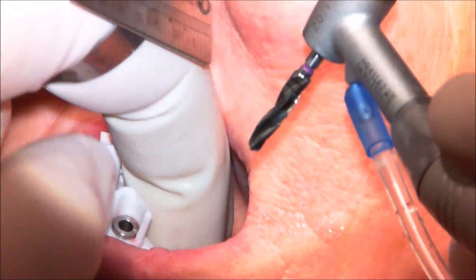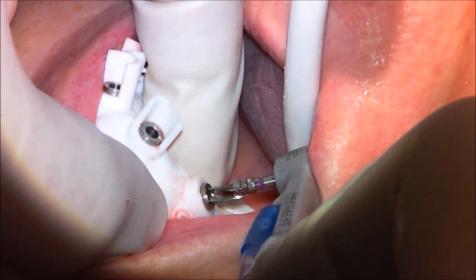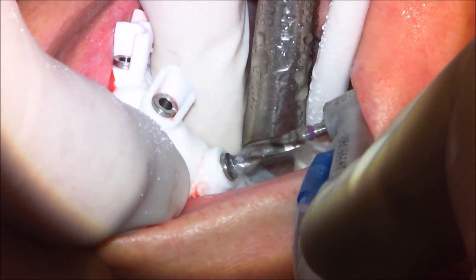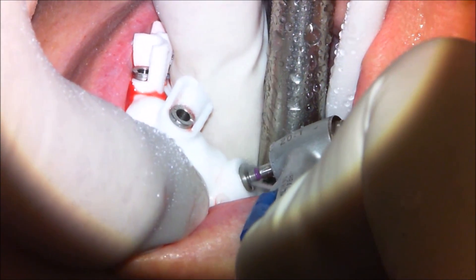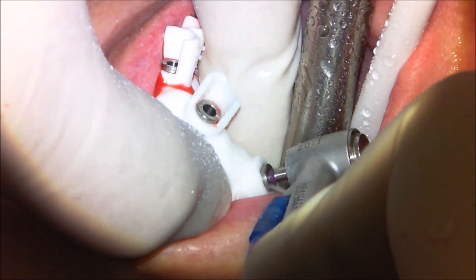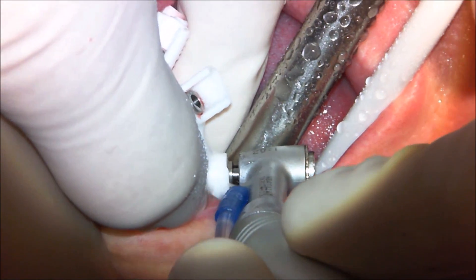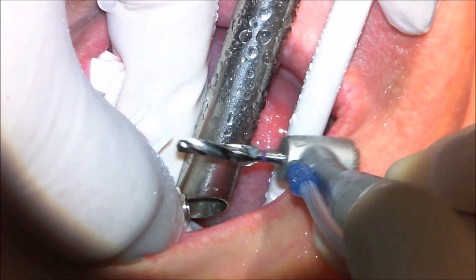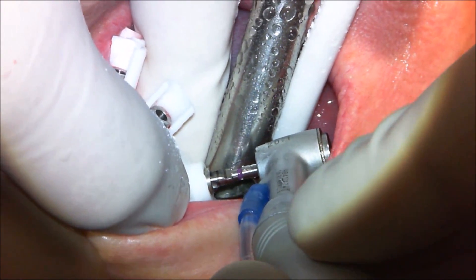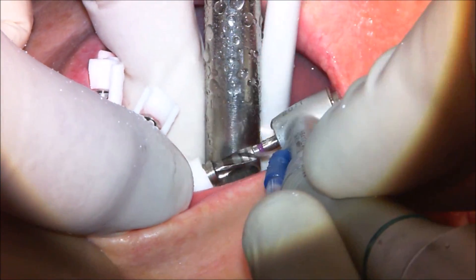I stress that because we'll be using rotary expanders to bring everything up to final size. For the two most posterior implants, I've gone to the drill for a 3.5 millimeter — my plan is to place a 4.3, so I'm going one drill smaller. This is the angled implant mentioned in the software portion. Same procedure — sink until it bottoms out on the guide, with plenty of pumping motion for irrigation and bone debris clearance.